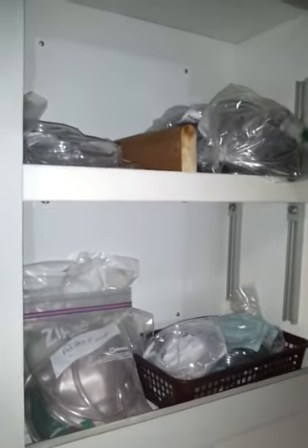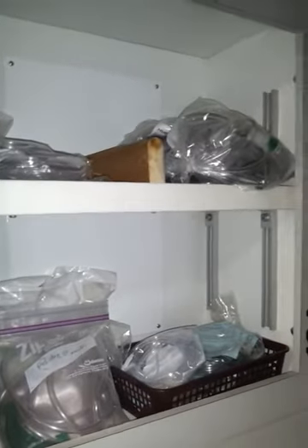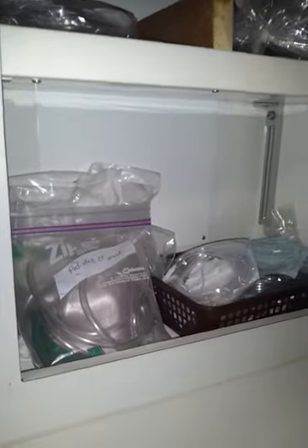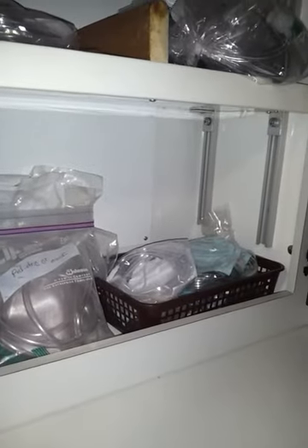In here we have our adult nasal cannulas and adult non-rebreathers. We also have a pediatric non-rebreather and pediatric nasal cannulas.